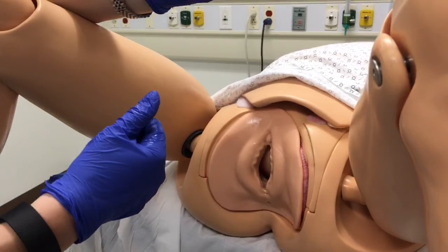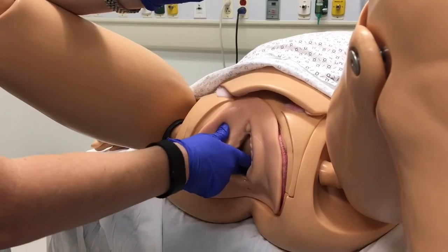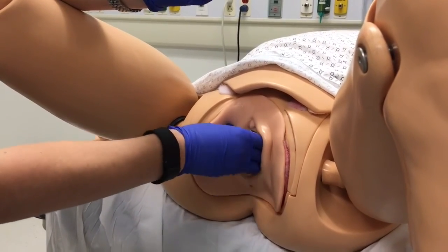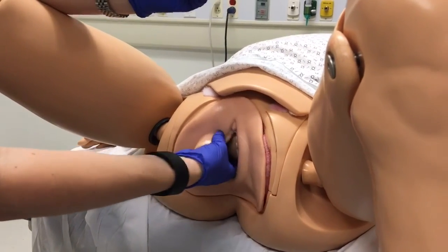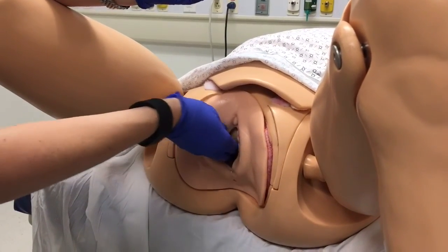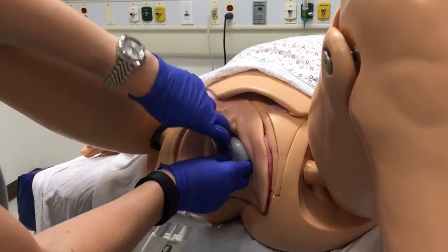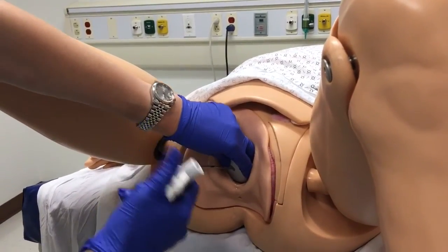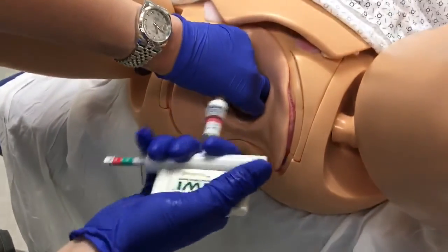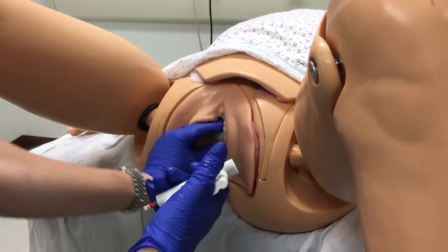Now I'm going to demonstrate actual placement of the vacuum. First, I'm going to feel for fetal station, confirming it's at least +2, and then I will confirm fetal position so I know where to accurately place the vacuum. I will then grab my vacuum and place it on the flexion point, feeling around to make sure no vaginal tissue is entrapped. I will then pump up the vacuum to adequate suction indicated by the green line, and again feel that no vaginal tissue is caught.